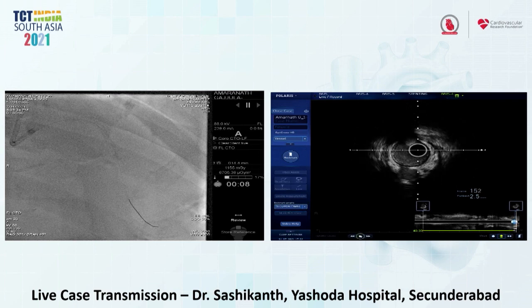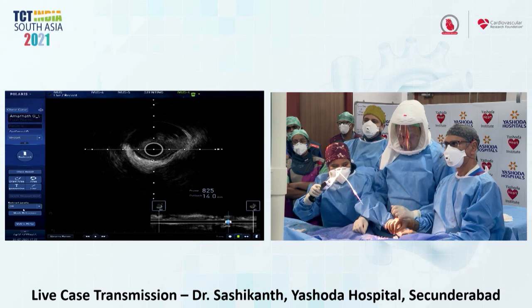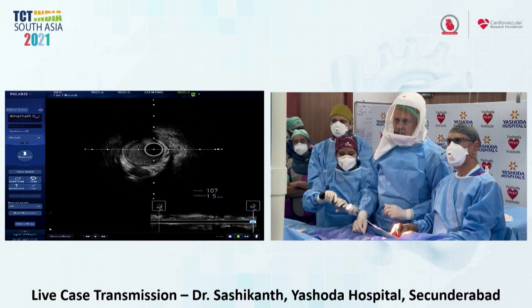And I actually think if you're looking from the circ, there's no way you're going to hang back into the left main because you know exactly where you are, and it's more safe. I don't think, frankly, without a large series of patients, at this point, we as a group should recommend routinely jailing IVUS catheters behind stents. I think the point is well taken.